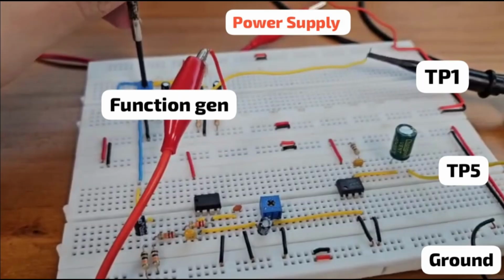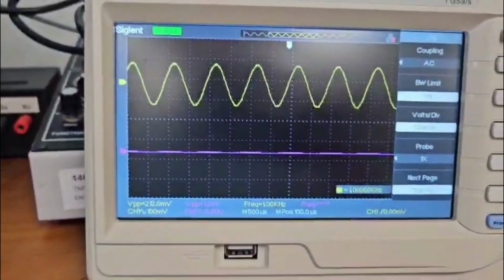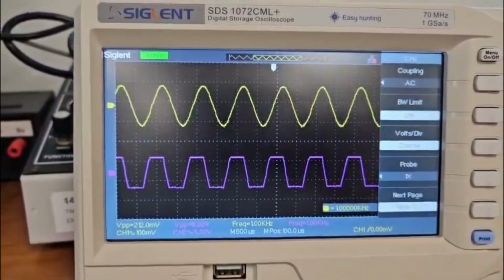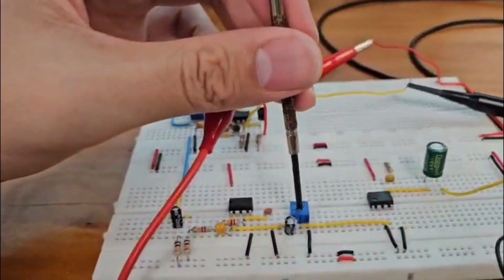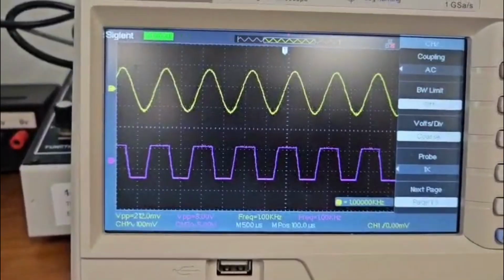For this final test, I connected the oscilloscope probes to TP1 and TP5 to observe both the input and the final output of the system. The function generator and power supply were left untouched throughout. At TP1, we can see the small heartbeat-like signal from the pre-amplifier stage. And at TP5, we observe the fully amplified output from the LM386N1 power amplifier.